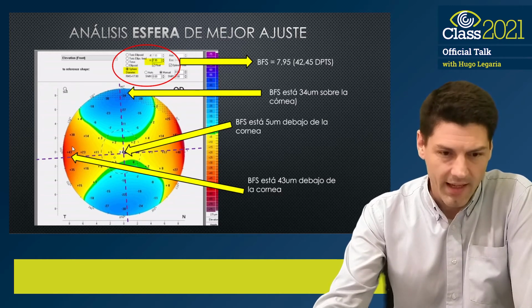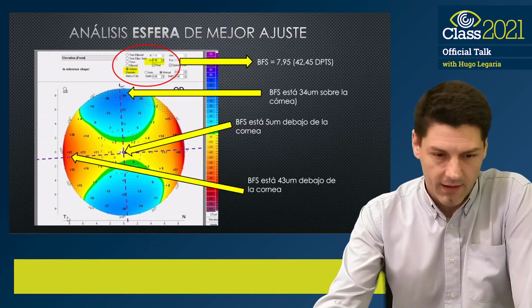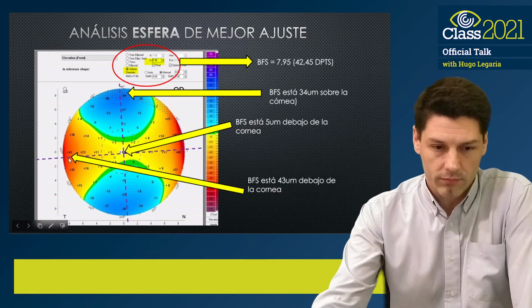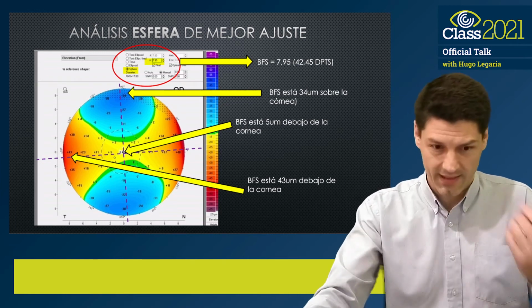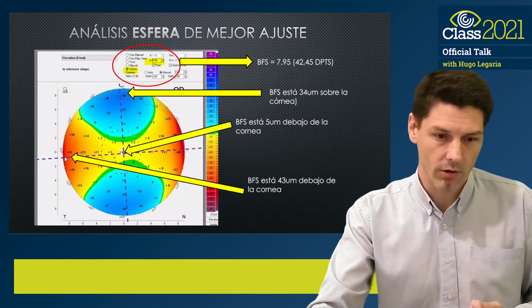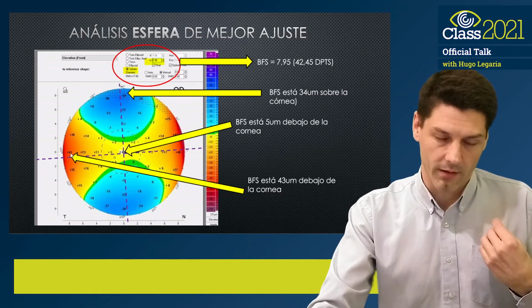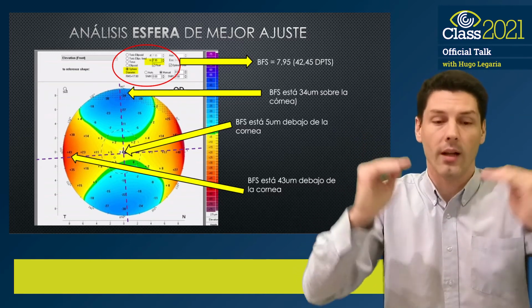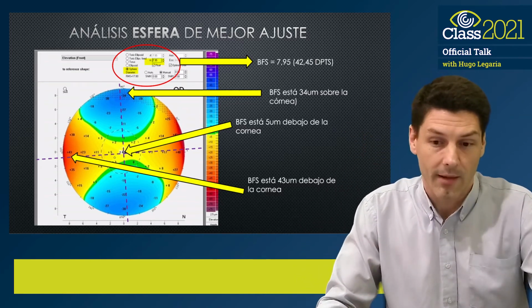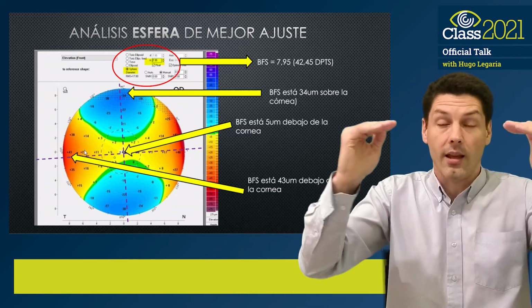Analyzing this line of numbers that mark us 43 and 40 near the row of 8, they are close to 8 millimeters in diameter. And they are telling me that for a diameter of 8 millimeters, the cornea is raised 43 microns, compared to the expected reference of the map. And therefore, if I want the lens to support properly, I have to raise the edge 43 microns.